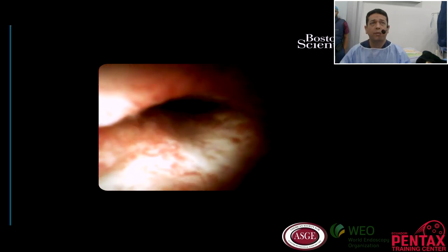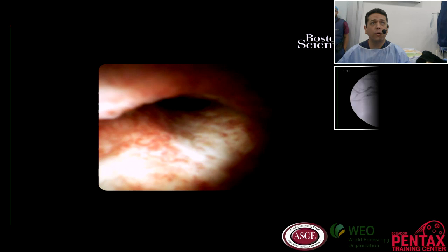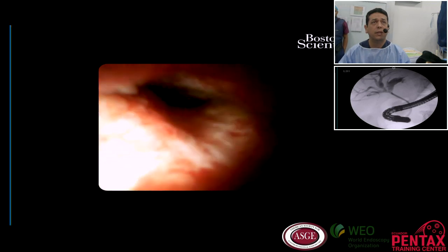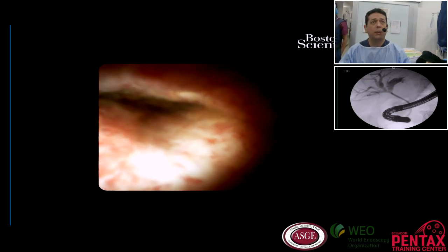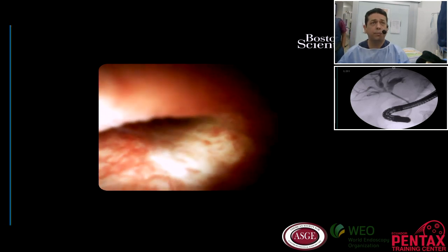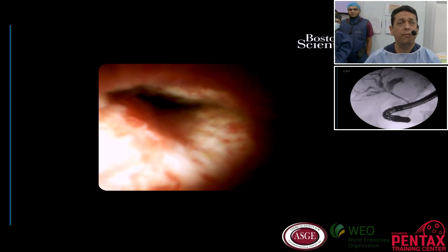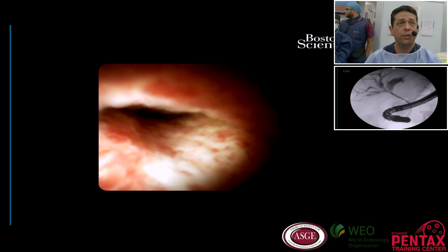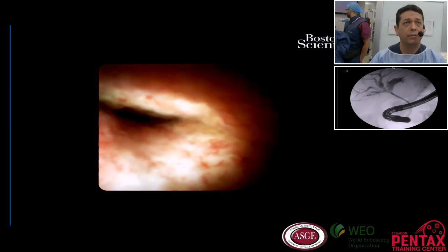And first we will start evaluating this area. You can see here with confocal laser endomicroscopy, just to see live the cells and to try to confirm the diagnosis of cholangiocarcinoma in this patient. And then, as a second step, if we confirm that, we will take some biopsies. And finally, we will start our treatment with radiofrequency. So this is the planning treatment for this patient today.